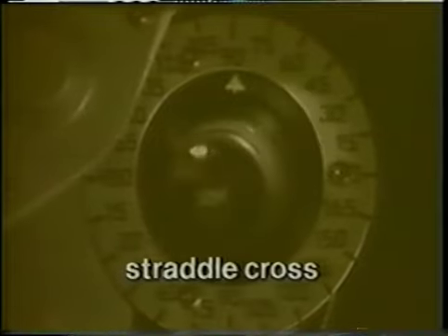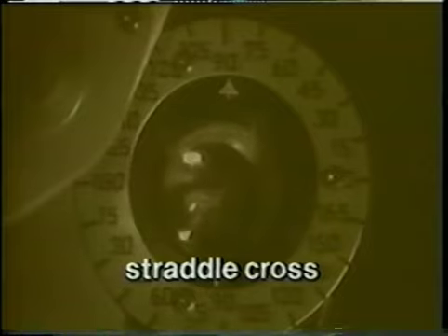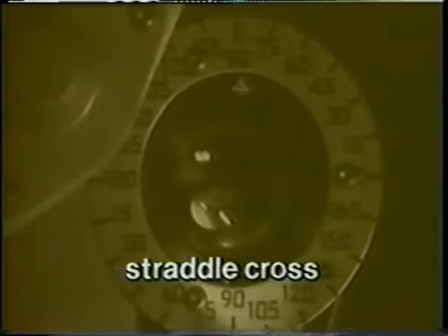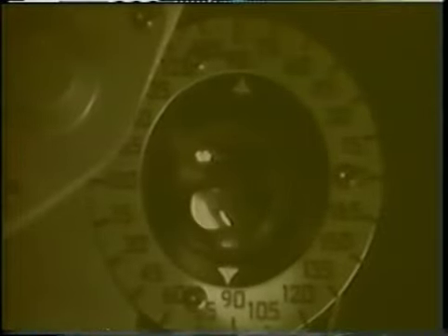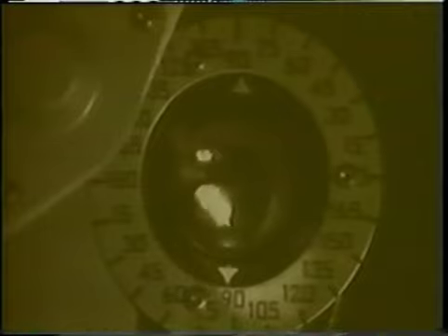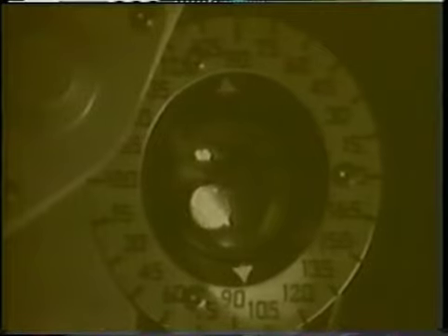Having moved in to get with movement in all meridians, we use what Copeland called the straddle cross. We check the reflex 45 degrees on either side of the correcting cylinder axis. If there is an axis error, the reflex will be narrower and brighter, showing better with movement in one of these directions. Here this occurs 45 degrees counterclockwise to the axis. This narrower, brighter reflex is called the guide line, and the plus cylinder axis should be rotated a few degrees toward it. The straddle cross is checked again, and the axis refined further if necessary until the reflexes 45 degrees to either side of the axis are equal.